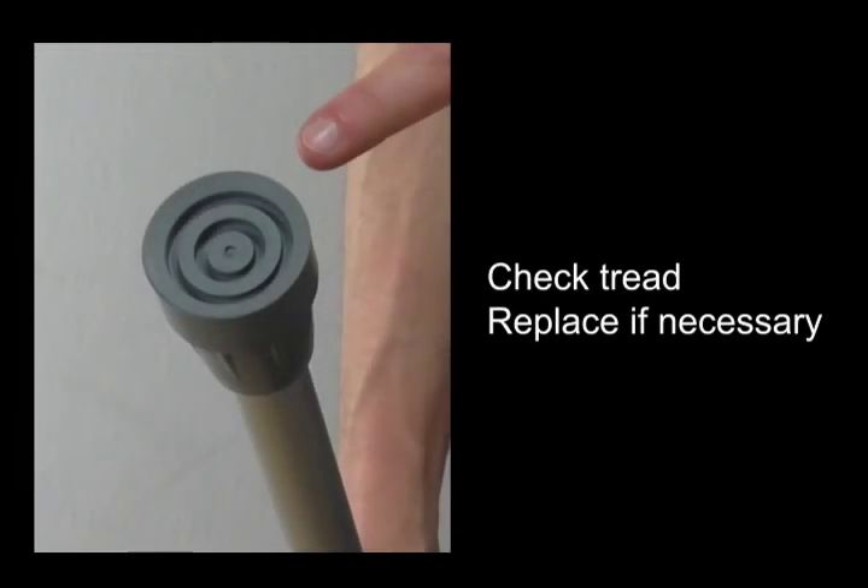First, check the stoppers on the end of the crutches. They should have plenty of tread on them so that they are safe if the surface is wet. If the tread is worn, you may find replacements from your supplier or chemist.